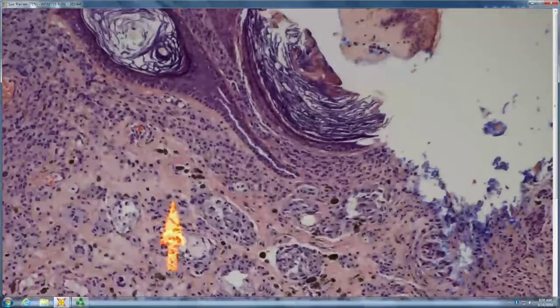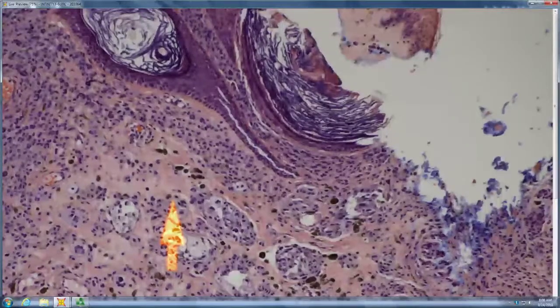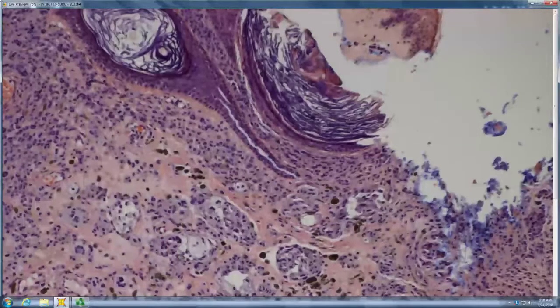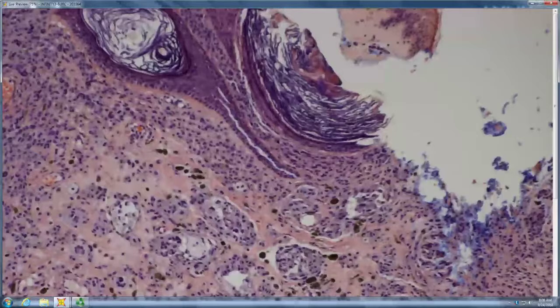Anyone want to jump in with a thought? So like a DPN, combined. Yeah, so a combined nevus. But what were you describing with that actually? Deep penetrating nevus. Okay. So deep penetrating nevus has the ample dusty gray cytoplasm, small hyperchromatic nuclei, inconspicuous nucleoli, smudged chromatin. And that combination of banal and deep penetrating nevus was the most common combined nevus sent in for consultation at Tulane, so Dr. Reed called it the common combined nevus.